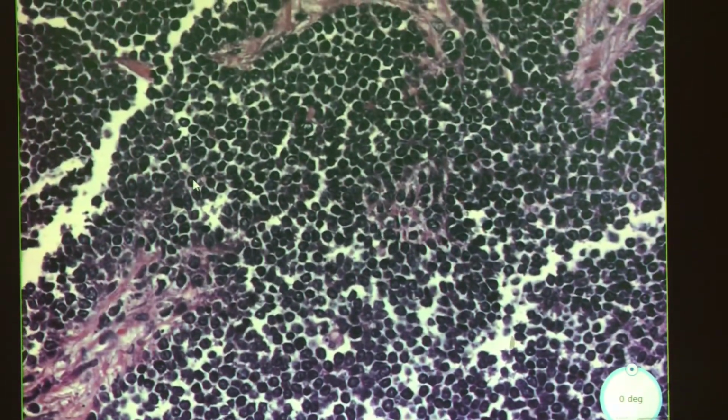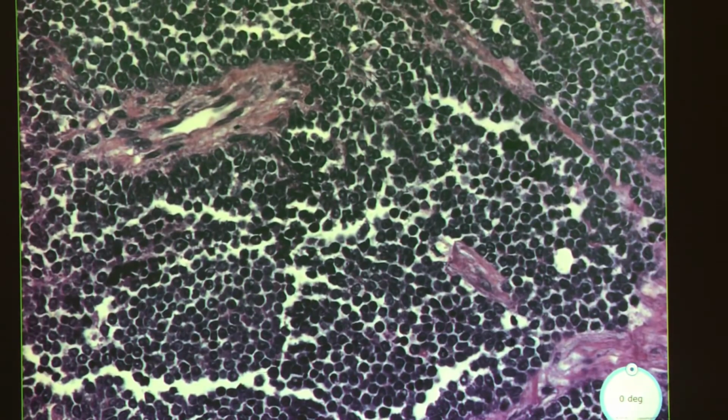There are, again, huge amounts of variants of architecture involving Ewing sarcoma. However, that's the base for all of them. Have your pseudorosettes, but pretty much what you should have is just the sea of small round blue cells and the vessels, okay?